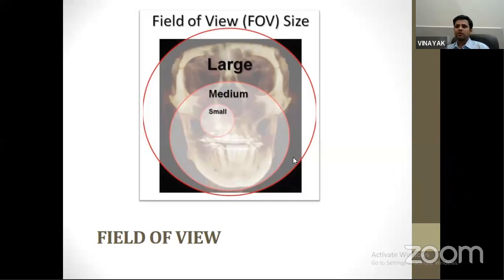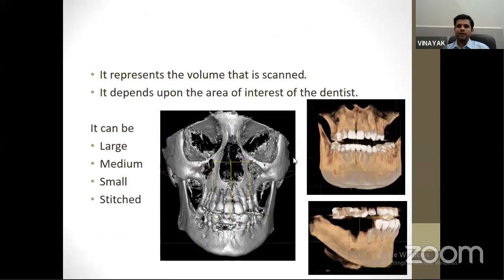Now there are some terminologies which I would like to tell you. There is something called field of view. Field of view is nothing but your area of exposure.